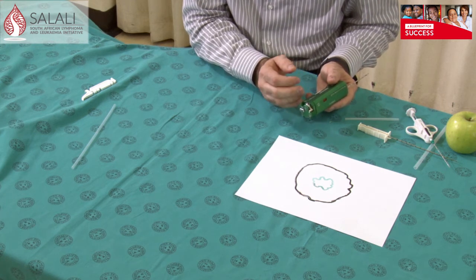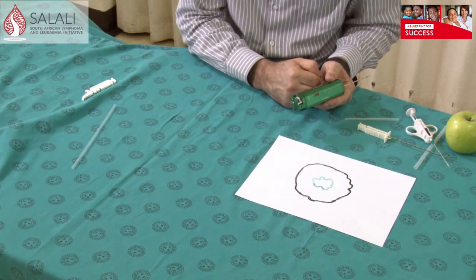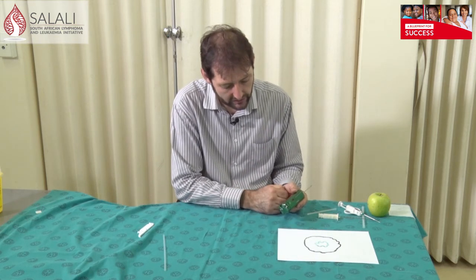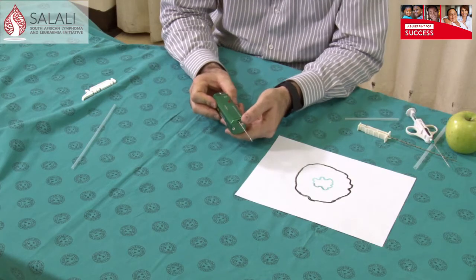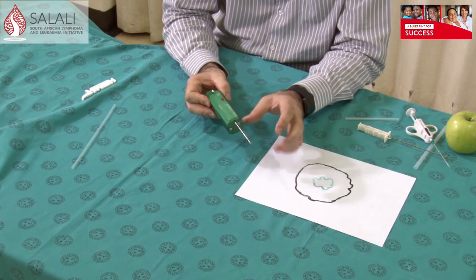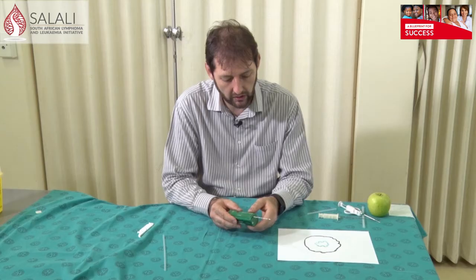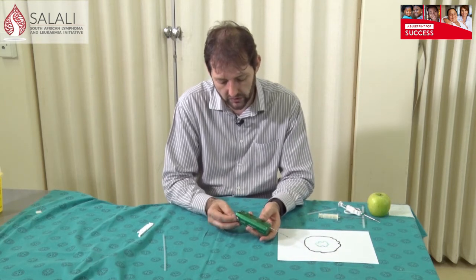This needle can be set to a 20mm biopsy or a 15mm biopsy. If you have a smaller lesion, maybe you want to choose the 15mm. If you've got vasculature or big blood vessels around your lesion, you may want to take a slightly smaller biopsy. You get different sizes and different length needles that fit into this system. This is a 100mm, 10cm, 14 gauge needle — the most common needle we use in our clinic. You can get longer ones and thinner ones depending on the clinical scenario.